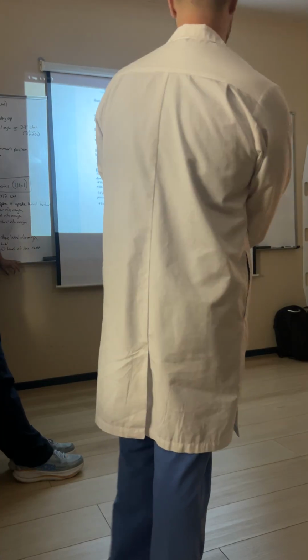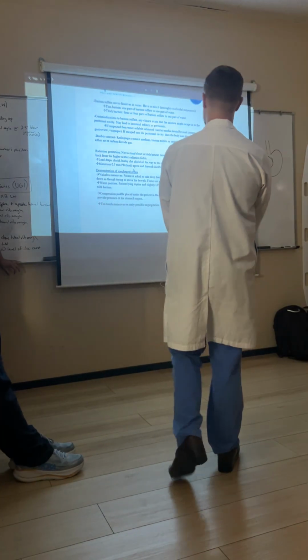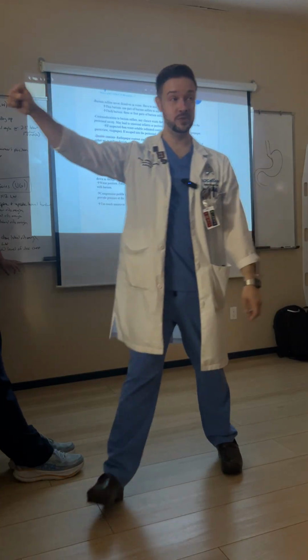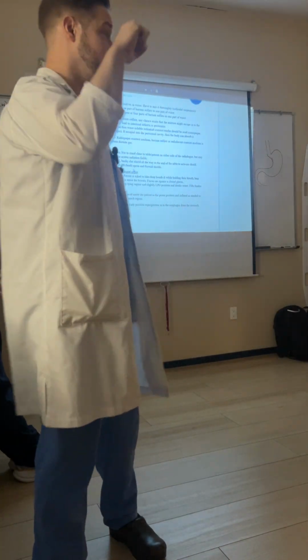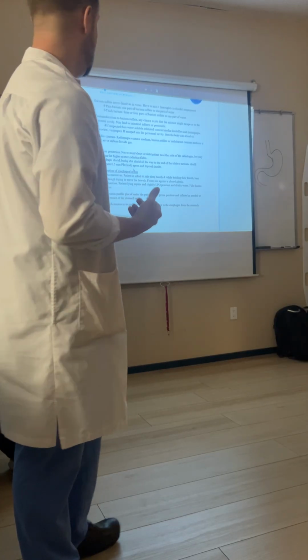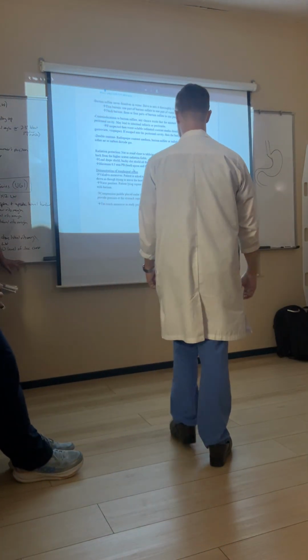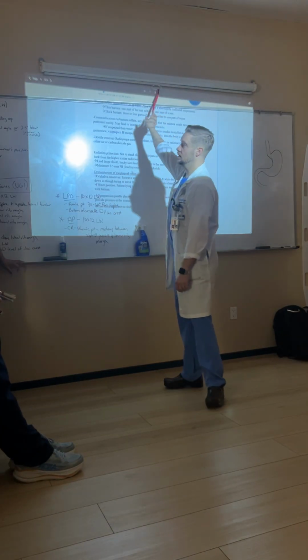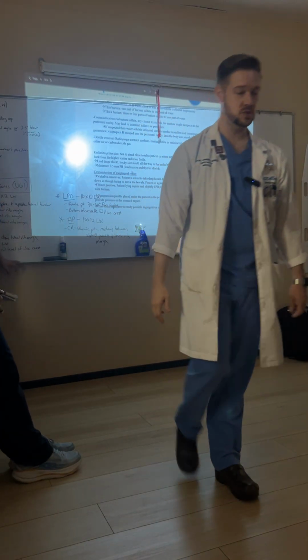No. Okay. So after the radiologist has come in and done all of their fluoroscopic exam with the fluoroscope, they're going to be watching things happen in real time, watching the patient drink this contrast, following it through. Then they're going to say, can you get me some overhead images? And these would be the overhead images.